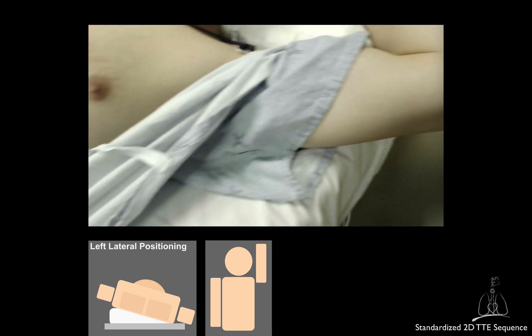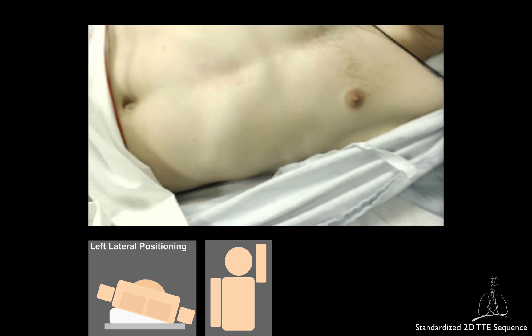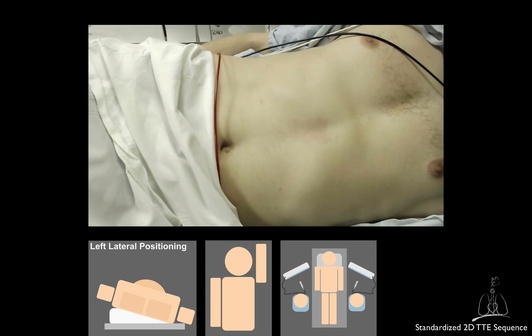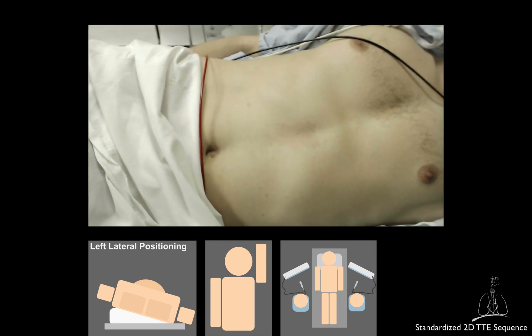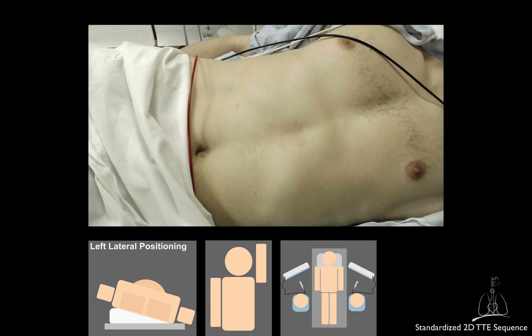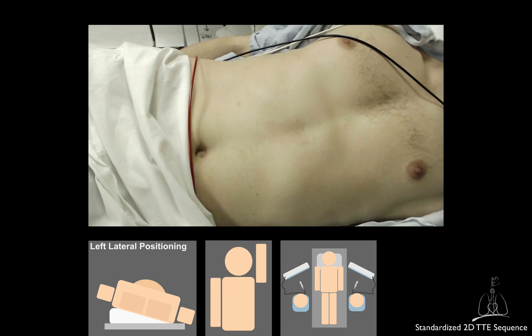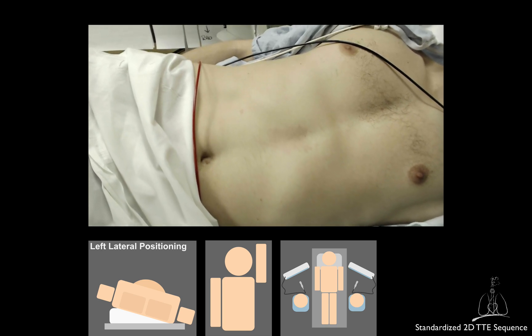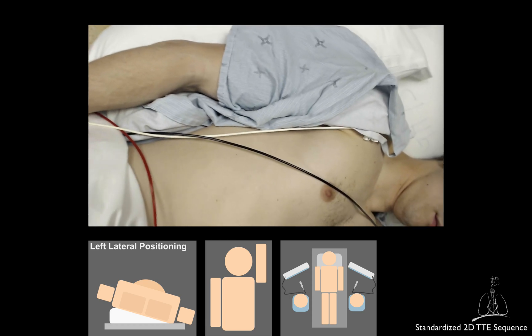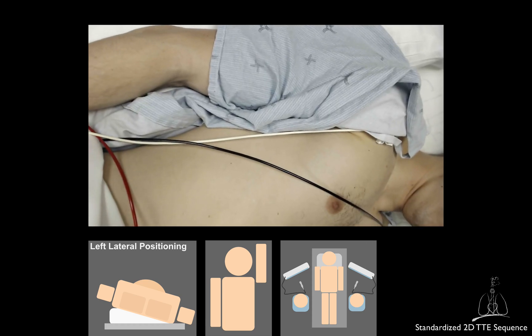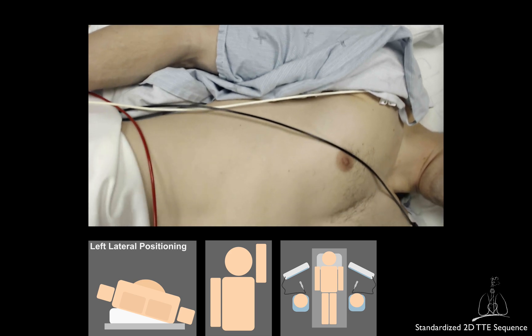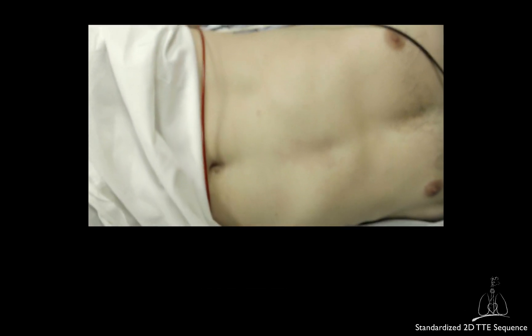Try to practice performing the examination from either side of the patient. In the ICU, one side may not be easily accessible due to the presence of other equipment. However, unless you are performing an emergency study, try to position yourself in a comfortable position. Make sure that the ultrasound system is located close to you and the patient to allow simultaneous scanning and manipulation of the settings.